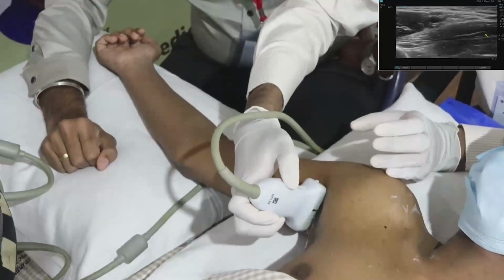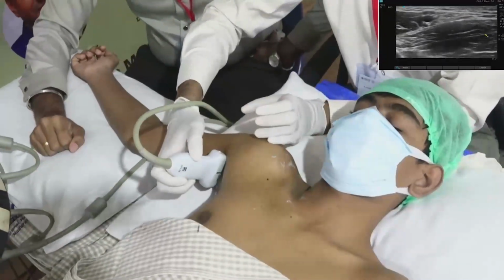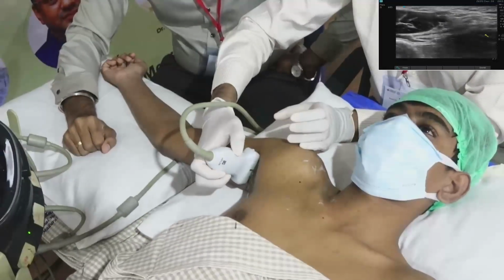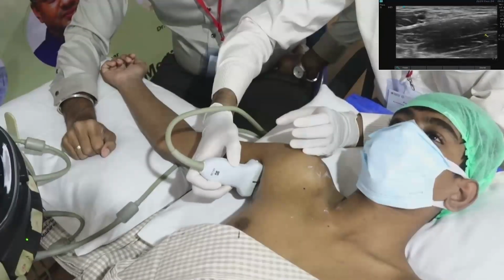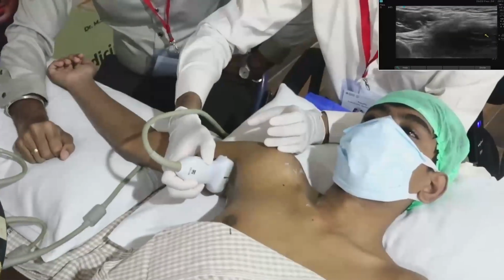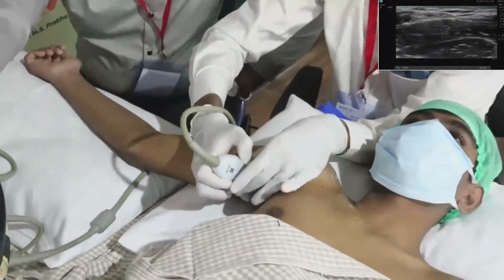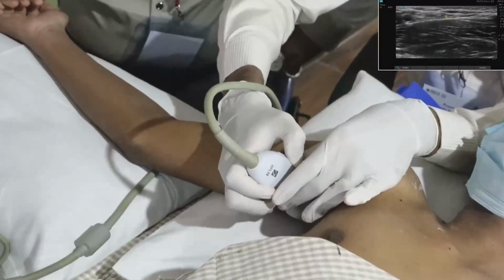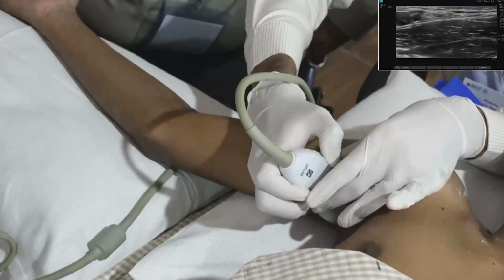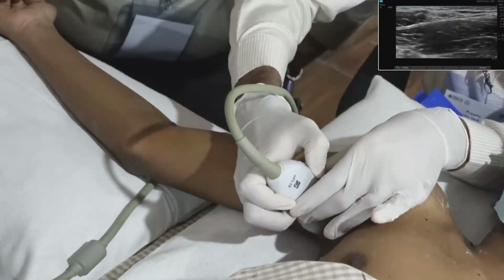So if you scan here, we have scanned all the major nerves: ulnar, radial, musculocutaneous, then median. Now we have to look for the conjoint tendon. If you go even more lateral, there is an area just above the conjoint tendon where our marker is. This is where we see the medial cutaneous nerve of the arm and the intercostobrachial nerve.